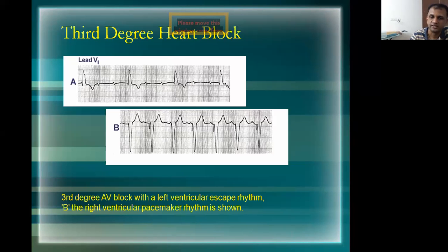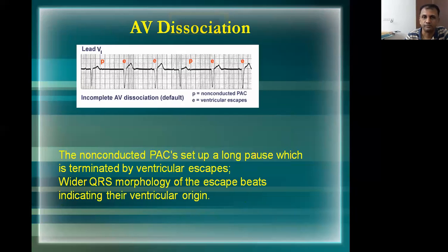It's another ECG example of third degree heart block. It's the same AV dissociation.